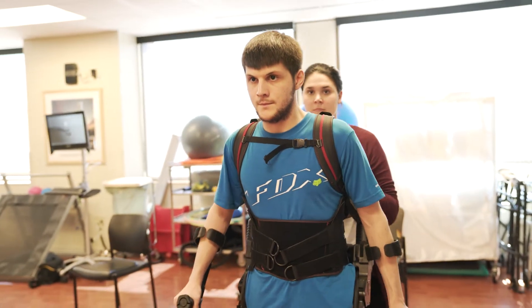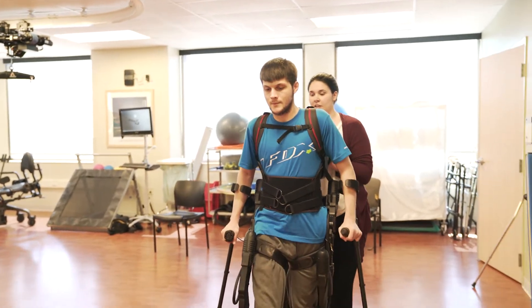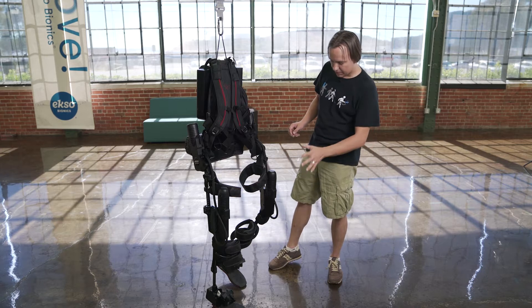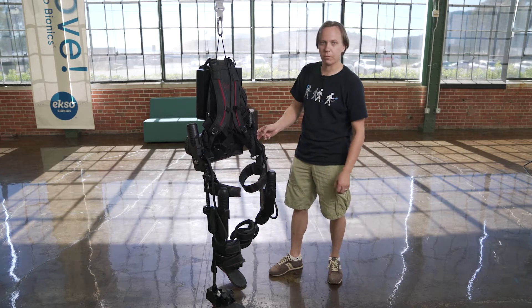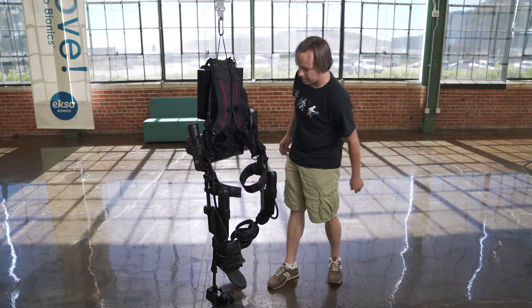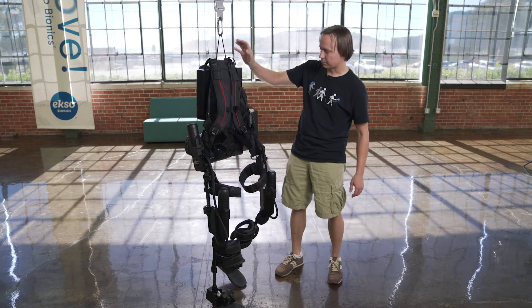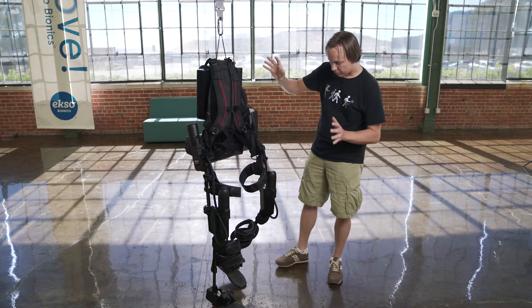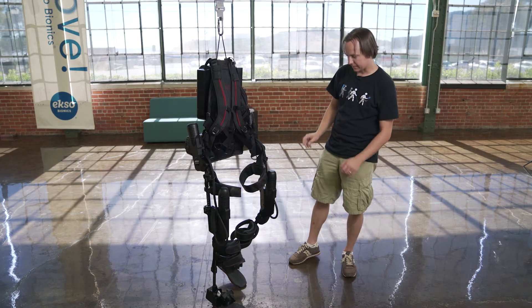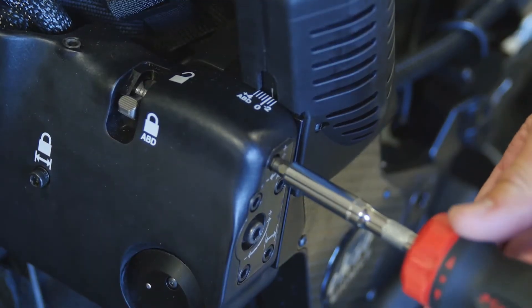The idea is that your therapist can get you up and walking sooner. I'm really a technology guy — I work on the robotics part of the device and have for years with our engineering team. The machine is built mostly of aluminum. We've got a bunch of carbon fiber composites all over it — you can see some here on the thigh straps and up and down on the leg panels. It's powered with lithium ion batteries in the back, and the computer is on the back. That's become a standard topology for exoskeletons, but we've gone some steps beyond that in the design.